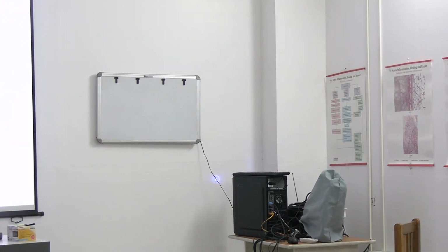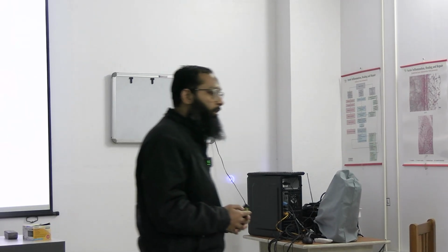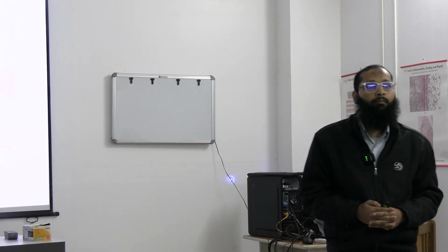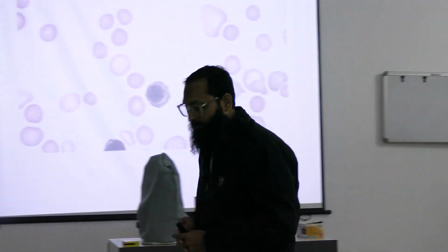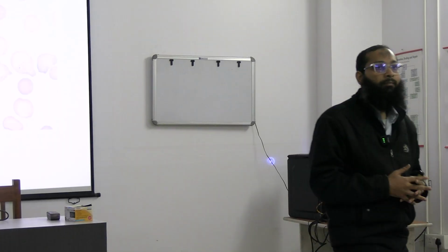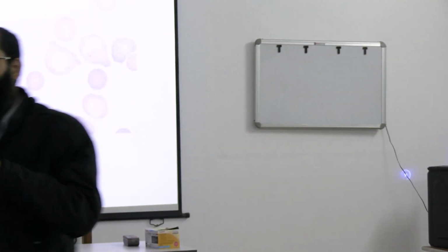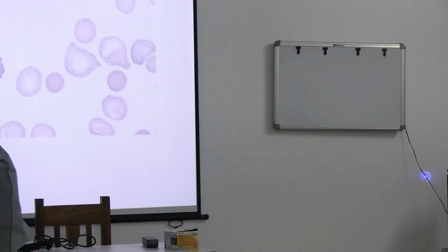Which kind of granules? Fine or coarse? Coarse granules. Okay. Color of the granules? Sir, blue. No. Eosinophil. Sir, brick red. Brick red colored. Yes. Brick red colored granules are there in the eosinophils. Nucleus? It is a bilobe shape. Yes, very good. It's a bilobe nucleus. Okay, sit down. Description of neutrophil, eosinophil clear to all?